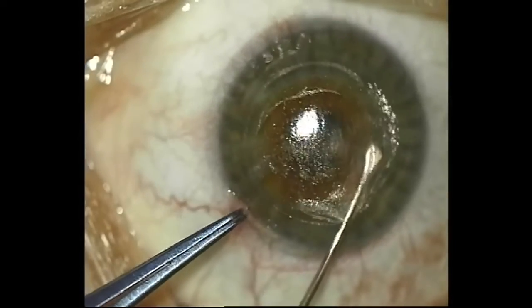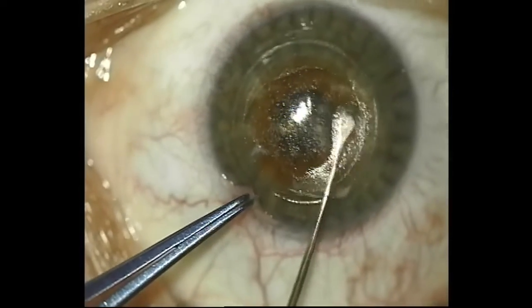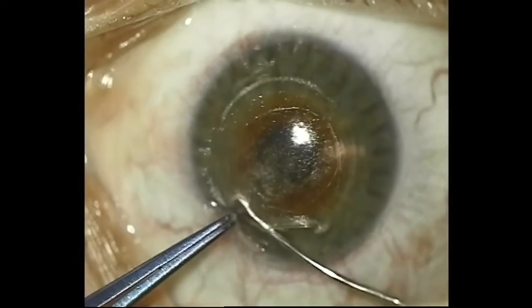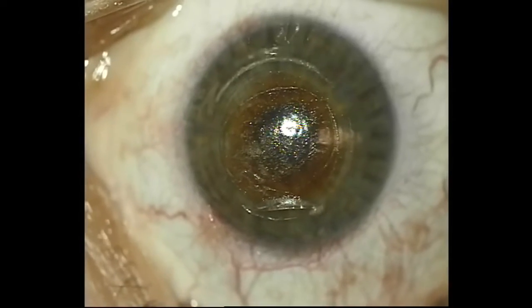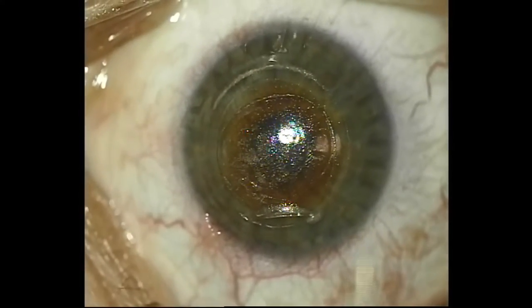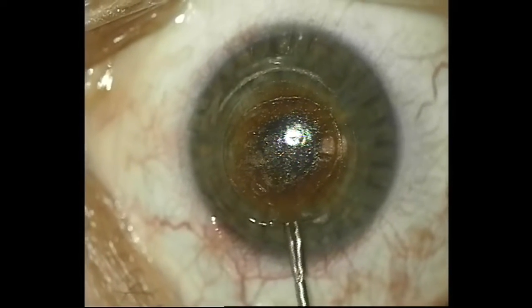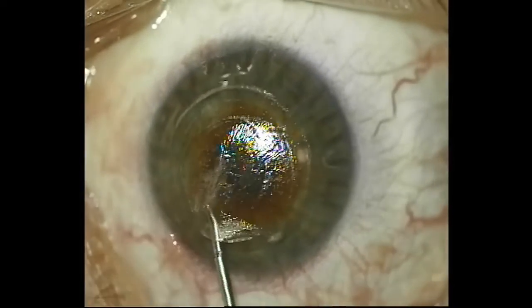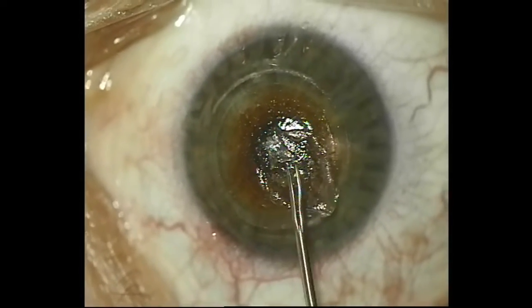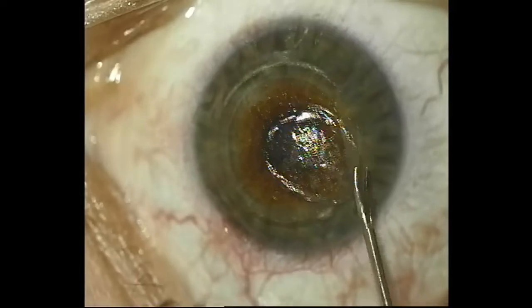Now I go back to the first anchor and dissect it, then move to the other side to finish off the second anchor — just being methodical, making sure every area is dissected. Now I take a special micro forceps designed for SMILE to reach in and remove the lenticule. Be very careful going in — don't pull too fast. Make sure you have the entire lenticule, and slowly loosen it in case there's any adhesion. And you see the lenticule coming out beautifully. My first case — what a wonderful feeling when that lenticule comes out. You can see how beautifully round it is. Make sure there are no small broken pieces — and it looks great.